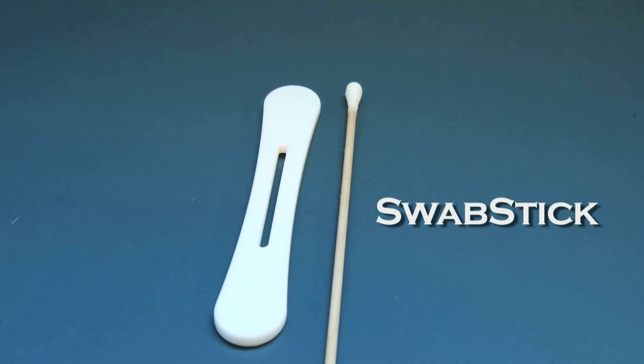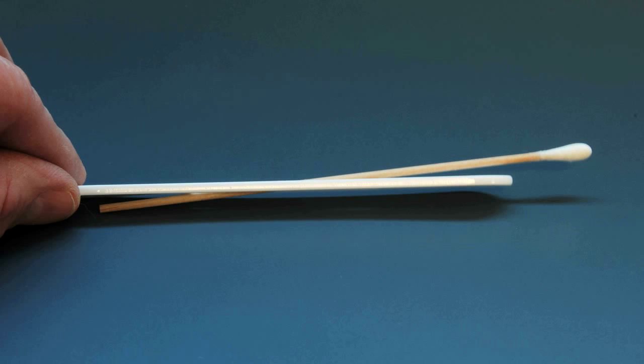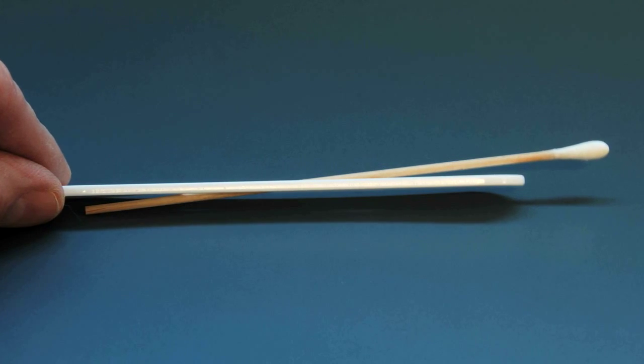Hi, my name is Sakina Oyuhuru, and I'm here today to talk about my product, SwabStix. SwabStix is a product that I developed based on my experience as a practitioner working in pediatrics.